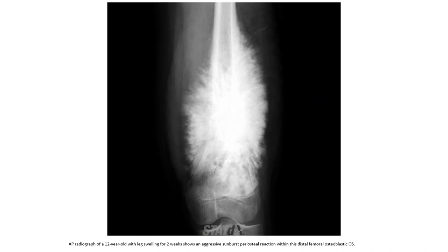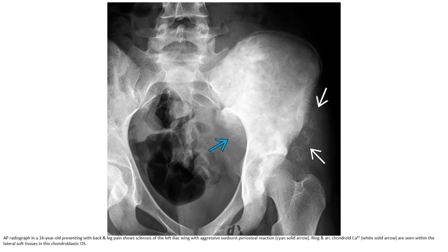This is an AP radiograph of a 12-year-old with leg swelling for 2 weeks, showing a sunburst periosteal reaction in the distal femur. Also shown is an AP radiograph in a 16-year-old with back and leg pain, demonstrating sclerosis of the left pelvis with aggressive sunburst periosteal reaction and ring-and-arc chondroid calcification within the soft tissue.